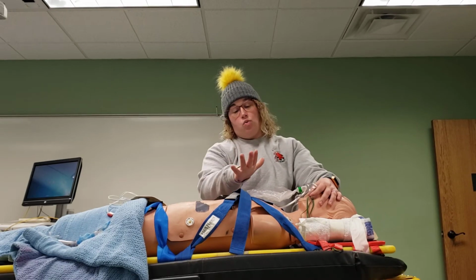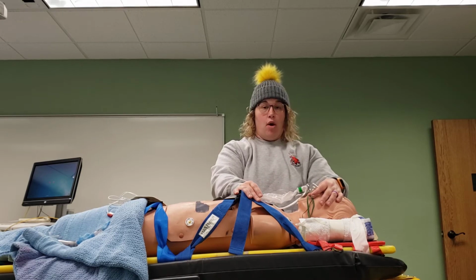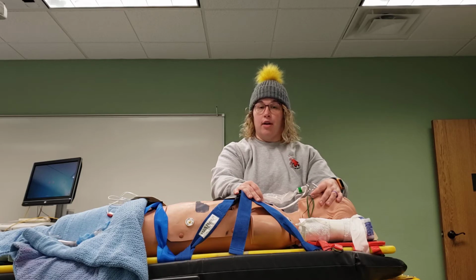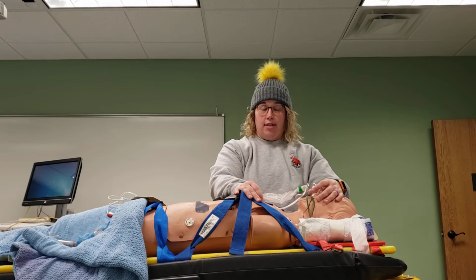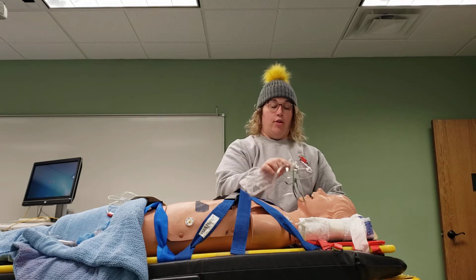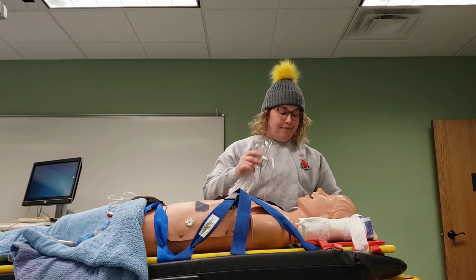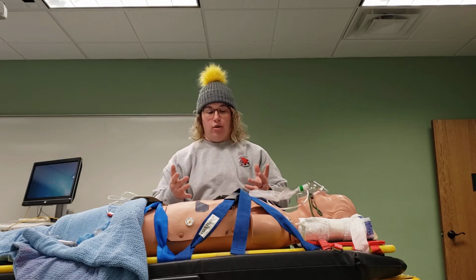So especially where it's one person CPR, or maybe you are part of an advanced life support team where the other person is focusing on delivering medications, an advanced airway should be the very last thing we worry about. It is acceptable to do passive oxygenation in the presence of compressions with a non-rebreather. So that would be the only time we're putting on the mask to a person who's not breathing. So in this case, passive oxygenation, I'm the only one here.